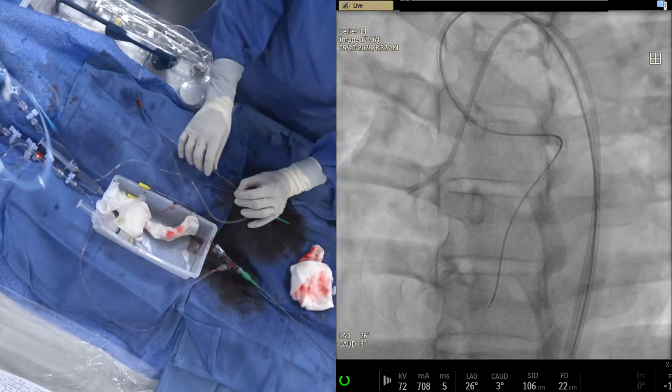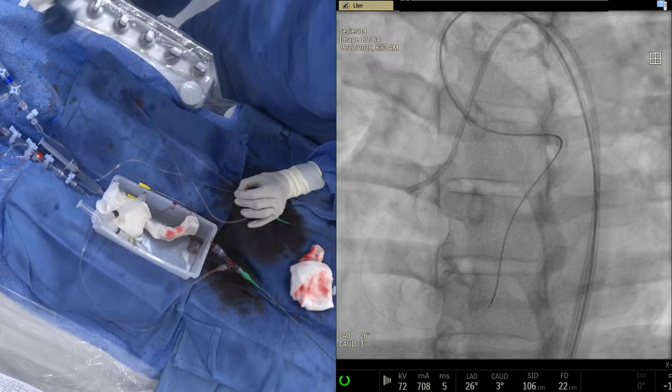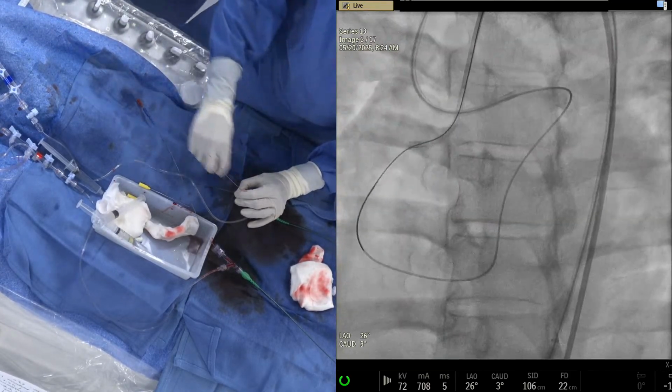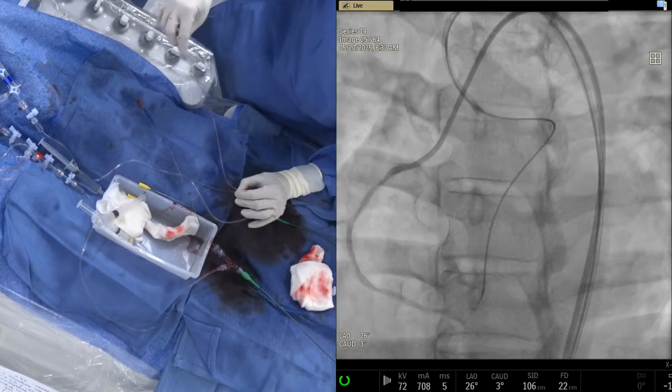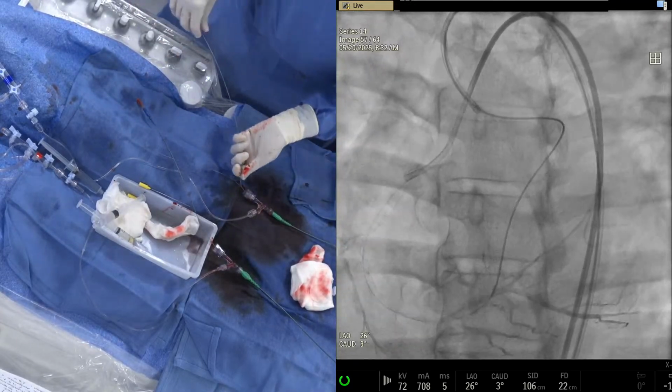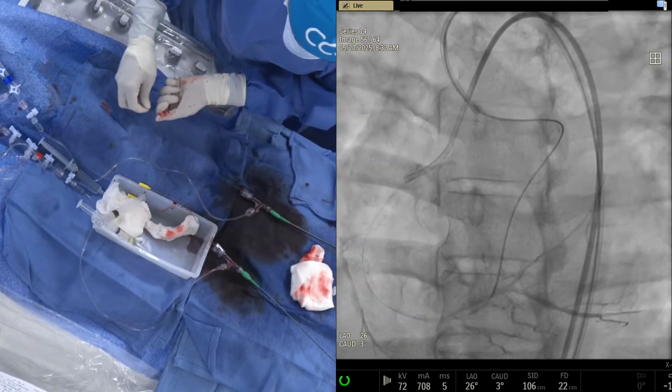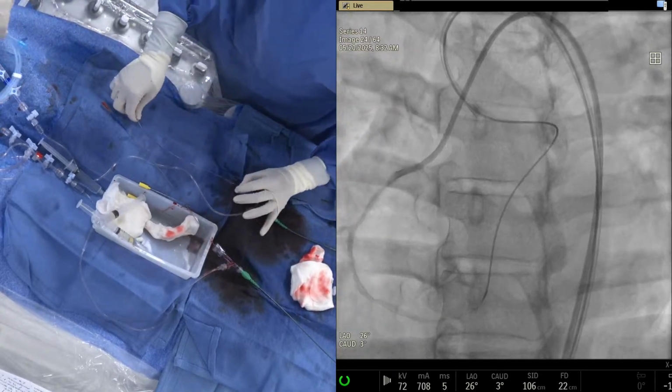How can we get the IVUS ready also? There is a disease there. Bad disease here. I think the wire is doing all that. Okay, give me antigrade and then we'll remove this wire. We have to show how to remove this wire.